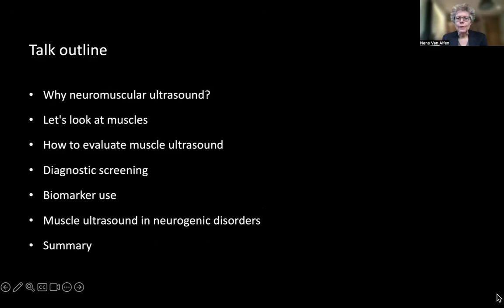So what are we going to talk about today? Well, first, a very quick credo of why I think people in neurology should learn how to use ultrasound as a diagnostic tool alongside your EMG and other diagnostic tools. And then I'm going to show you some examples of how you can look at a muscle and assess what's going on, and how to evaluate muscle ultrasound formally for diagnostic screening, but also for biomarker use.